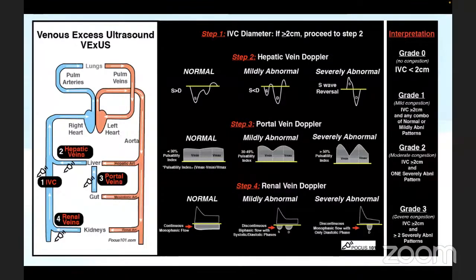We don't know, and they are still trying to add more organs into assessing this. Because RV and LV functions are okay in this patient and they're empty, yes, maybe we have to think of other things also, and we have to look at the blood pressures and all, and then decide. This is not the sole diagnostic modality in any way.